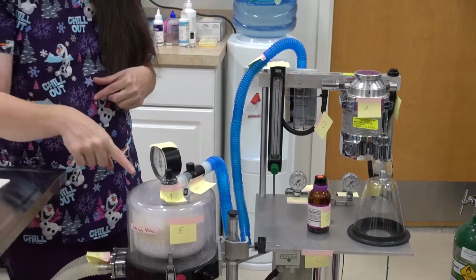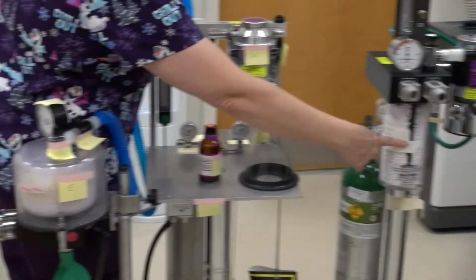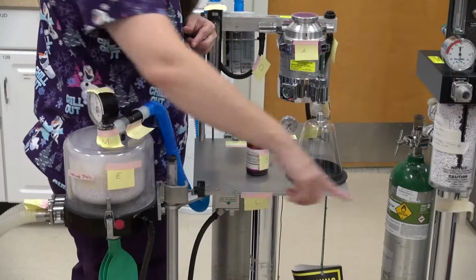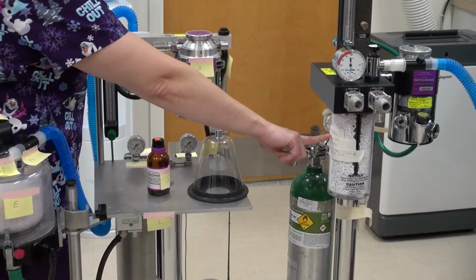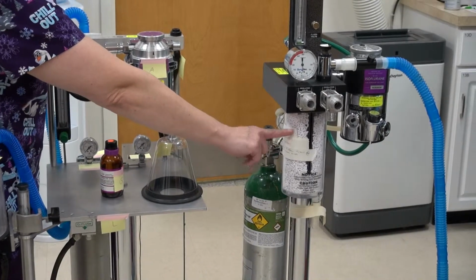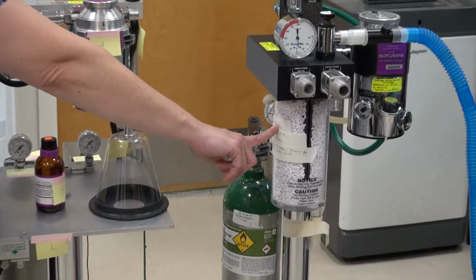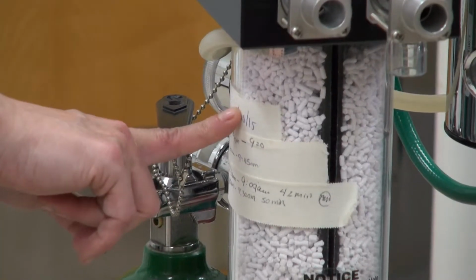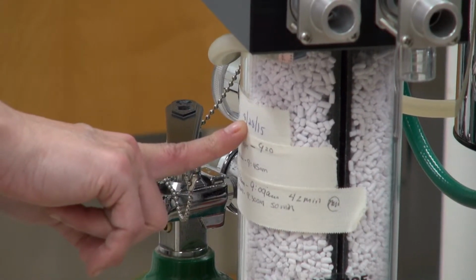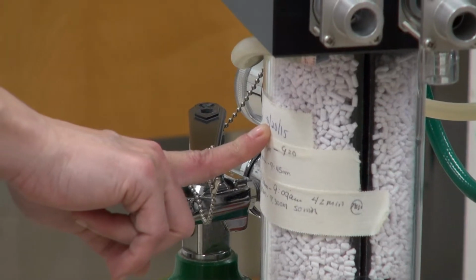We want to check our soda lime color, right? Our soda lime's either in here or in here. And I love this machine right here because it says soda absorb change, and it'll give us a date and a time. You should do that every time you change your soda lime, okay? So that whoever's using the machine next knows when we started. And that kind of gives us a little bit of an idea.